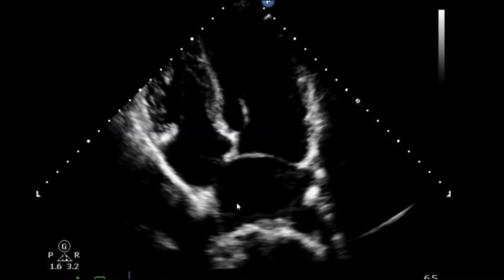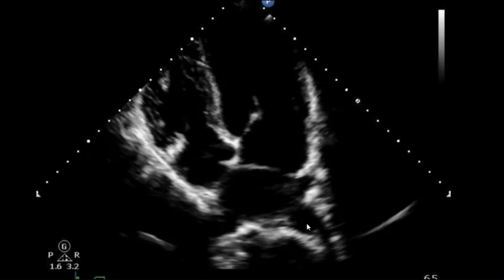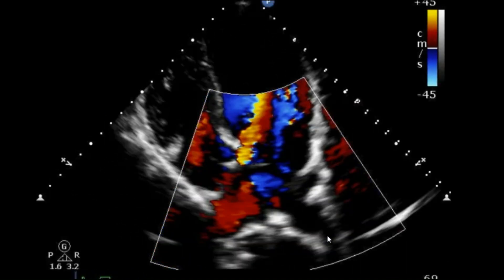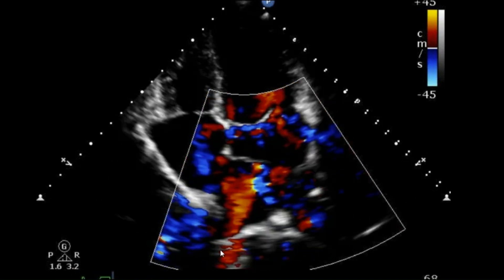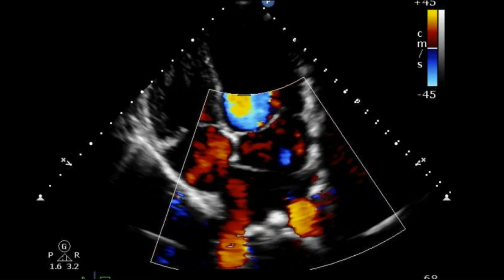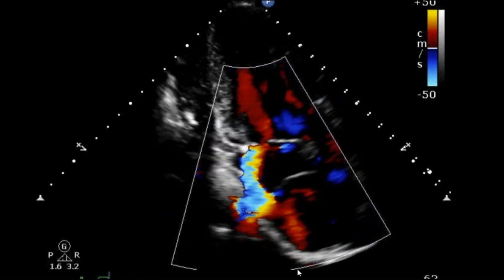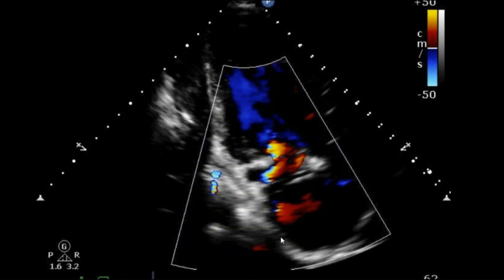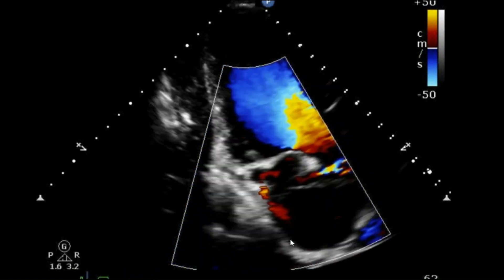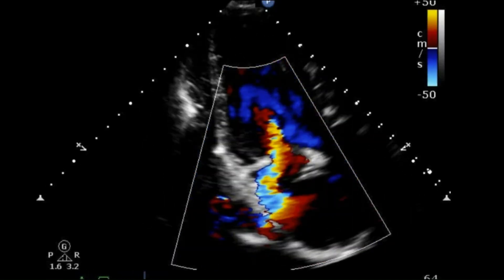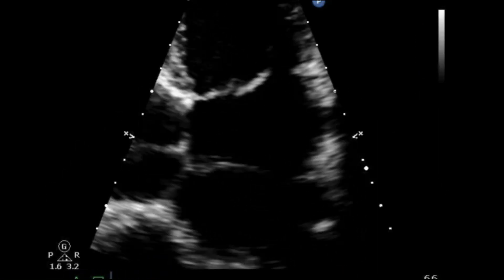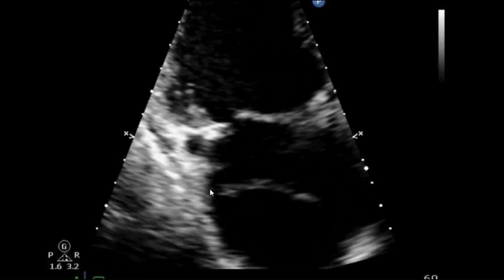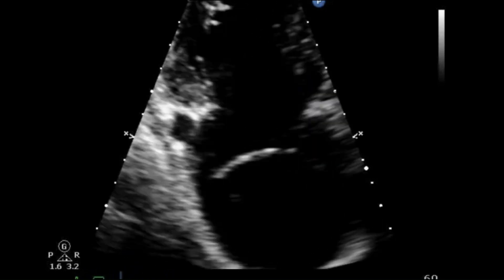When we go to the four-chamber view, we can confirm the membrane is below the level of the left atrial appendage, and similarly in the two-chamber view. We can see the pulmonary veins, and the pulmonary veins are enlarged, which is quite typical with this condition. Flow can be seen coming up through there. In the two-chamber view, again, there is a real absence of the membrane in that view, indicating a large non-restrictive opening.